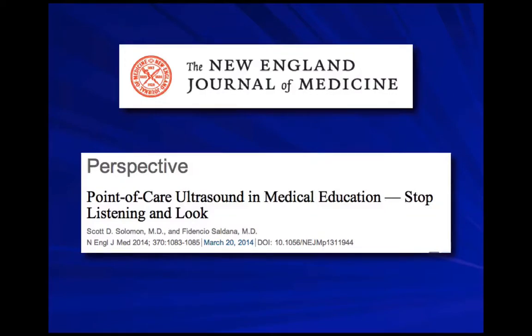But there's a lot of momentum with point-of-care ultrasound and medical education. And there's an article that basically said, point-of-care ultrasound, stop listening and look. And I don't think we're going to throw away our stethoscopes yet, but definitely a lot of good things with ultrasound.